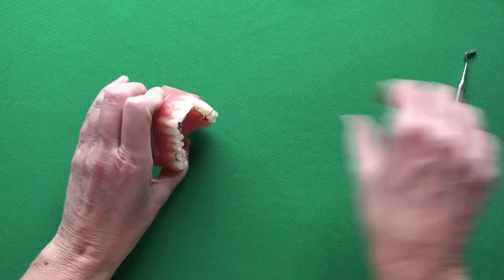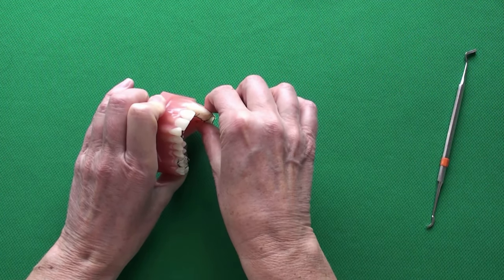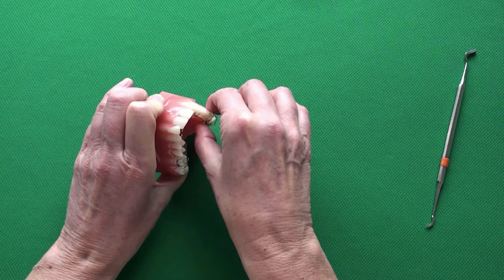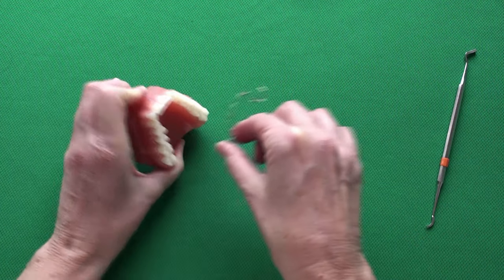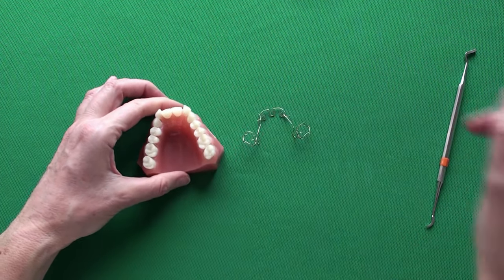With all retentive areas cleared, you are able to take the ELF out.